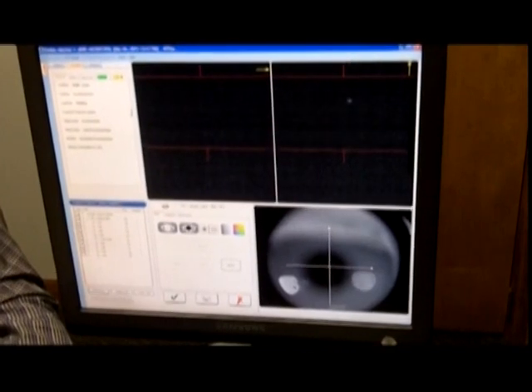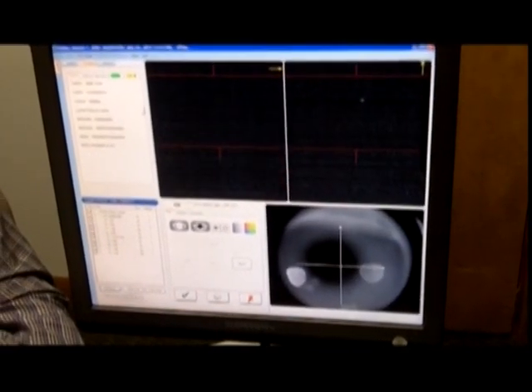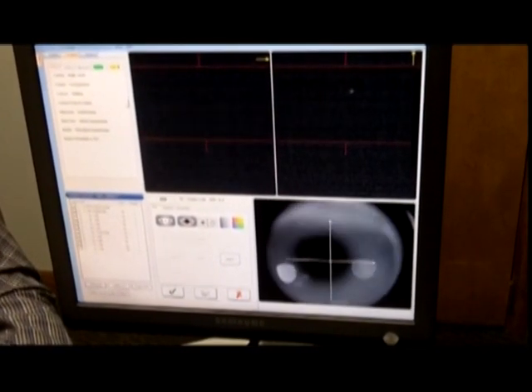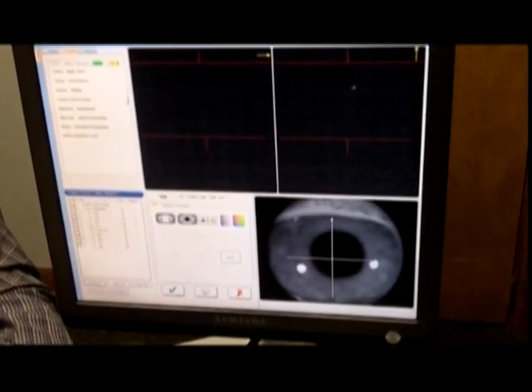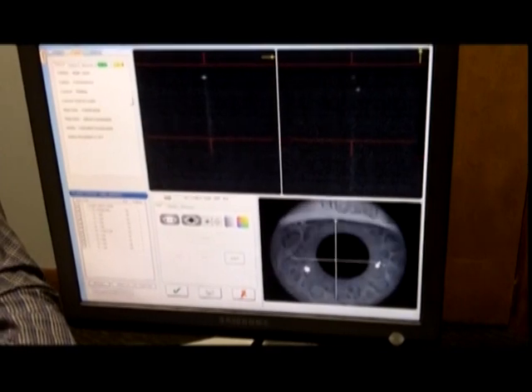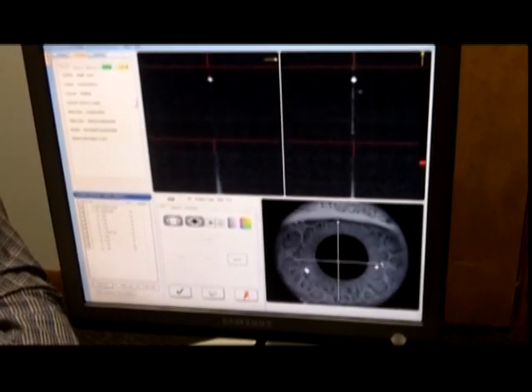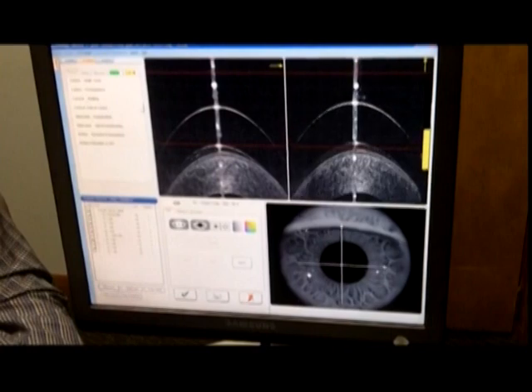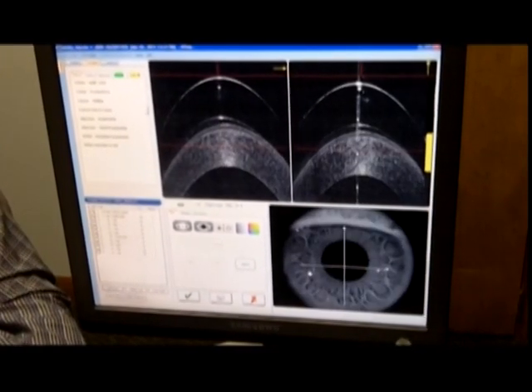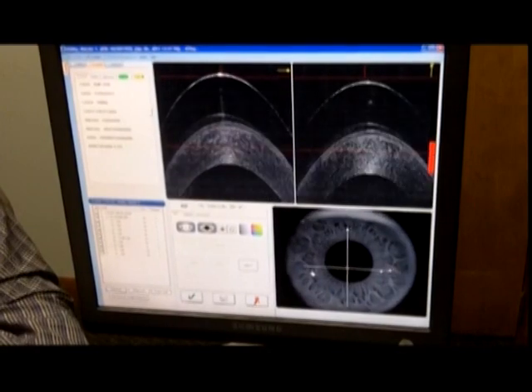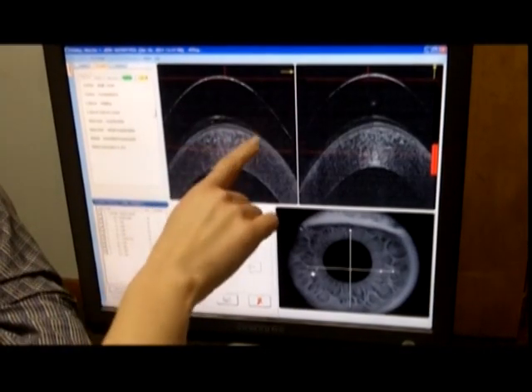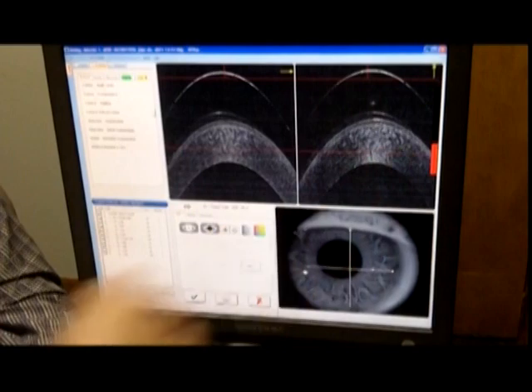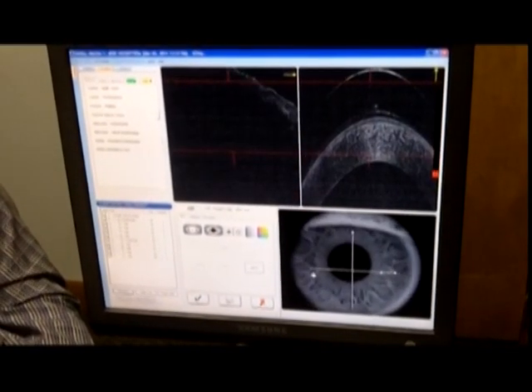When you have the CAM lens on, it's very important that you do not make any fast movements because you will poke the patient in the eye. I'm going to line up my crosshair in the center of the pupil and go in very slowly until I get a clear image. The image is pretty clear so I'm going to go really slow until I can see the scan come up in the two boxes above. Now I'm going to have him blink. We want to be able to see the back surface of the lens and the cornea — we want to tell them apart so we can see exactly where they're sitting on the cornea so Dr. Wilcox can analyze the fit.